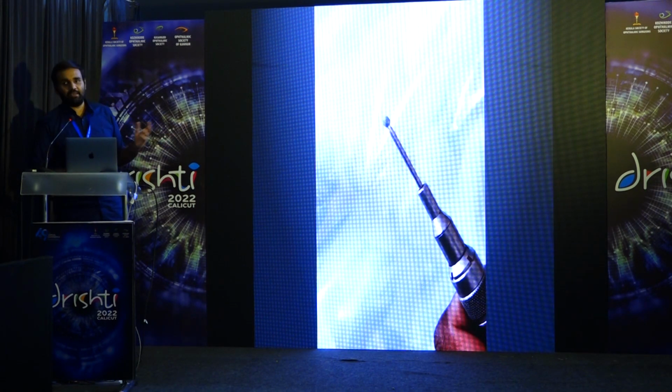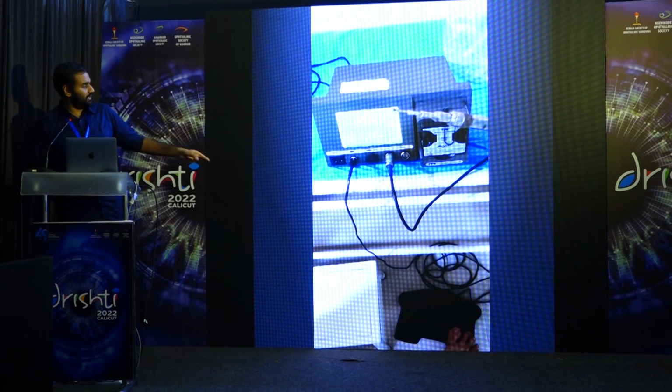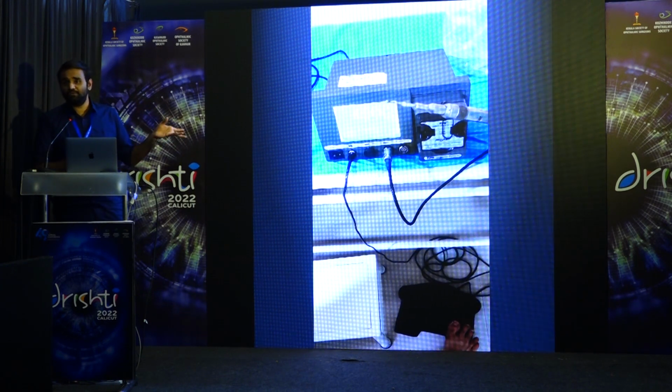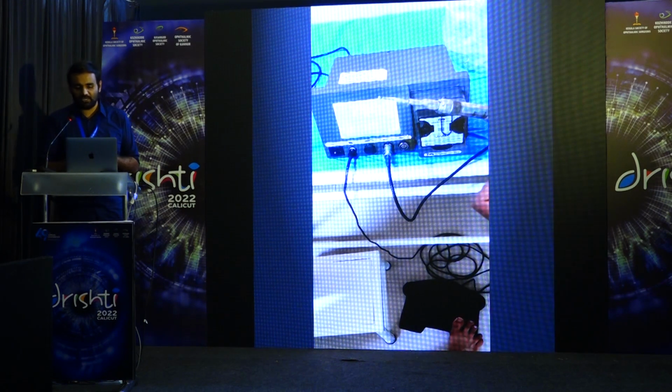This is basically a diamond burr. This is the drill that I use. It's got a diamond tipped burr at the end which contains basically industrial diamonds. They're not the diamonds we buy at the jewelry store. Now this is the drill itself, so it's basically speed controlled with a foot switch. It goes up to 50,000 RPM, but for corneal procedures we use somewhere between 4,000 to 8,000 RPM.